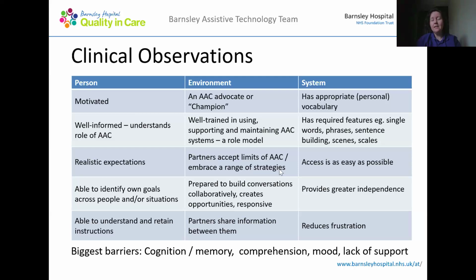So I'm changing the system a little to take those away. Maybe when they click on animals, it just has the key animals that are important to that person, rather than farm animals, zoo animals, sea animals, because the way the aphasia has affected them, that's a bit harder for them.